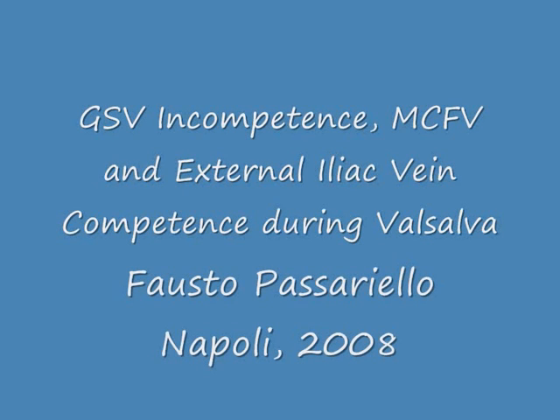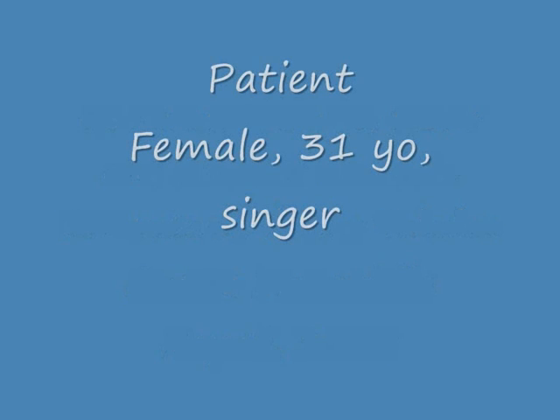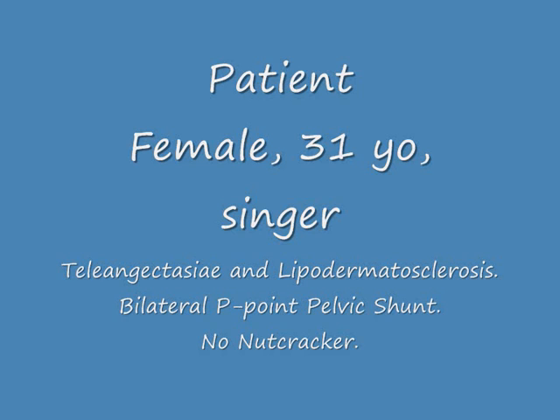Great saphenous vein incompetence, medial circumflex femoral vein and external iliac vein competence during Valsalva. A young female patient, 31 years old, an opera singer, came for a consultation, mainly for aesthetic problems of the lower limbs. Teleangectasiae and lipodermatosclerosis were clinically evident. An asymptomatic bilateral P-point pelvic shunt was demonstrated by the EchoDoppler, while no nutcracker syndrome was detected.